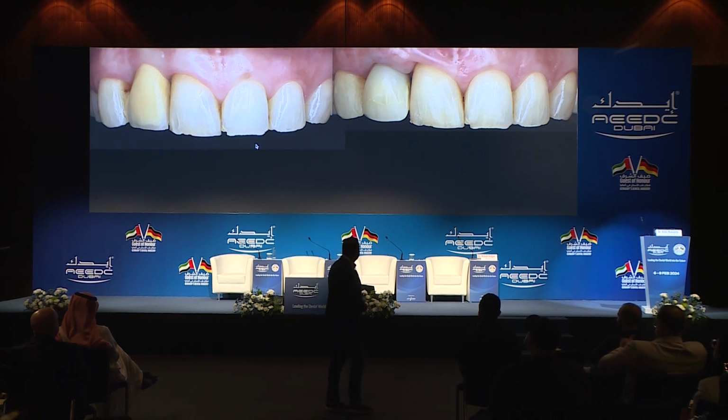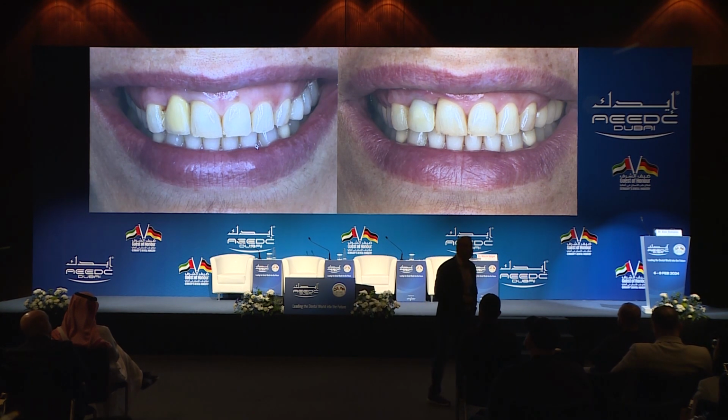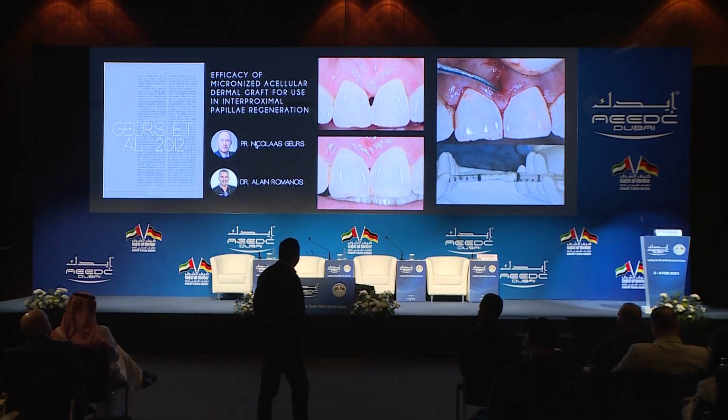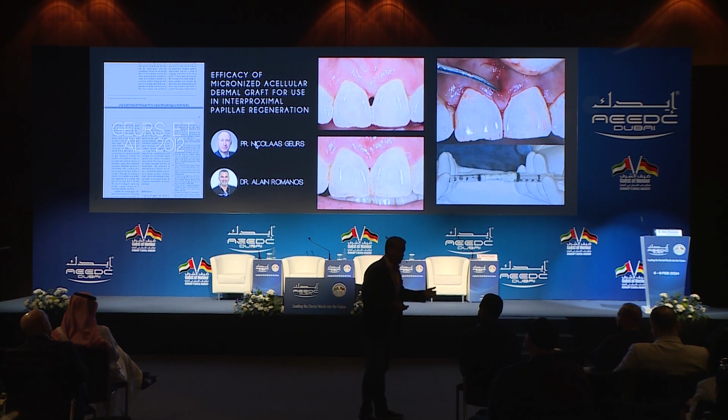And then, I did publish back in 2012 an article on injecting the papillas with filler. And in the study that we did, it was 50-50. 50% of the time we were predictable, the other 50% we were not. And I felt like this is a good case because she has a partial papilla. So we didn't have a full papilla. We did not have a missing papilla. We had a partial papilla.